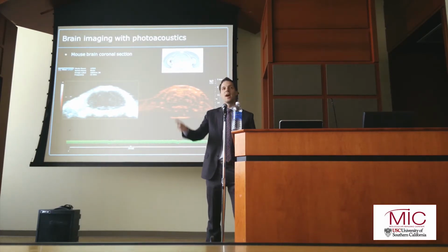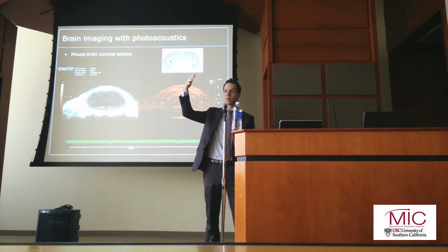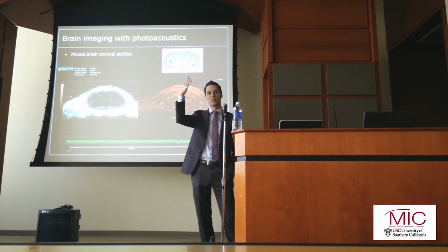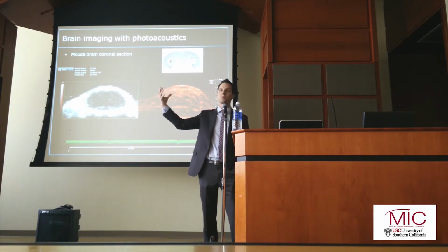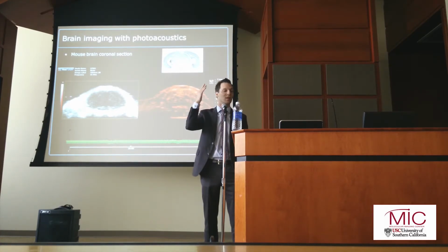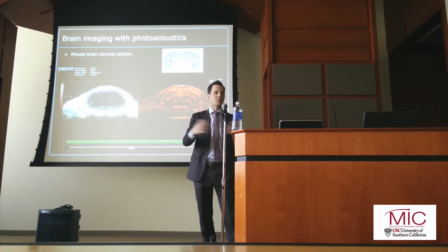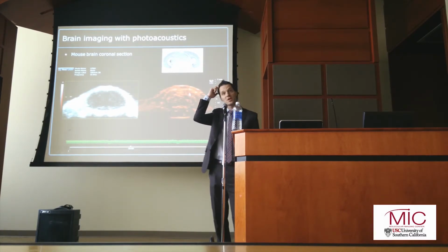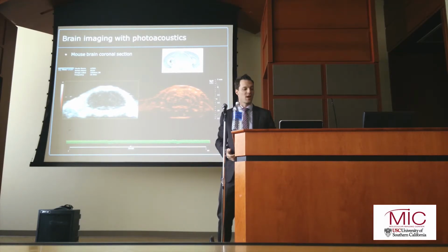Photoacoustics comes in, and instead of the situation with ultrasound where you need the sound to go in, then bounce off, and come back out through the skull, with photoacoustics we just need to get light in, and the sound only has to go one way. It only has to get out to make our image. So we imaged some animals, and we found, wow, the level of detail was much, much higher than we were able to see in ultrasound. And again, we're looking at vasculature within the brain.